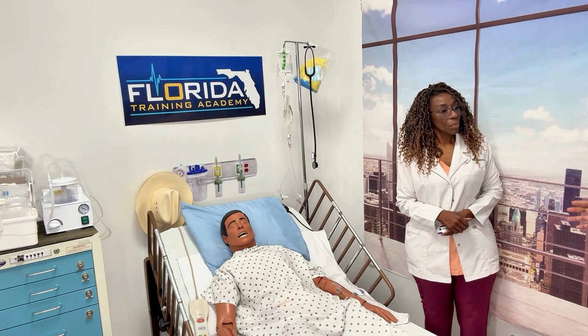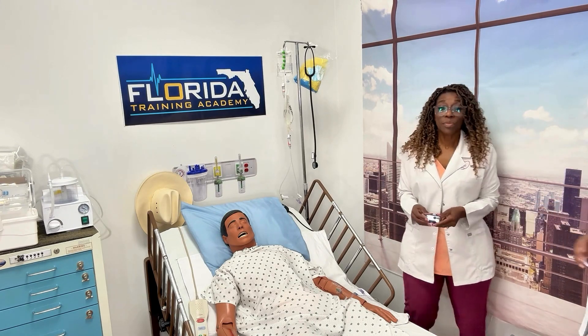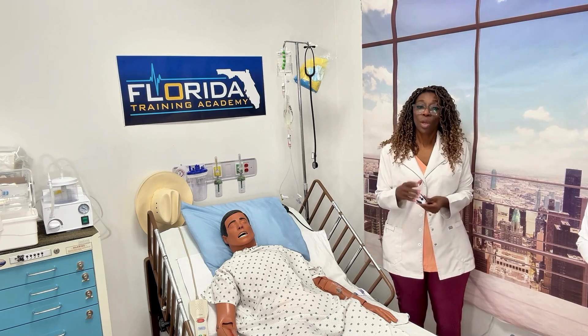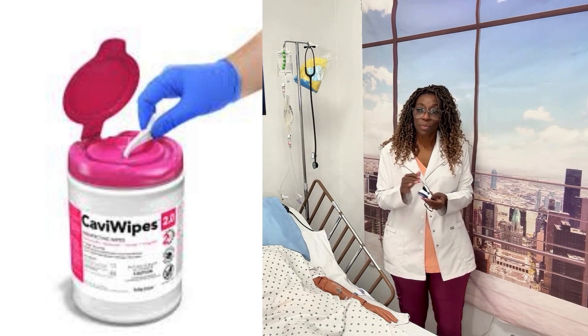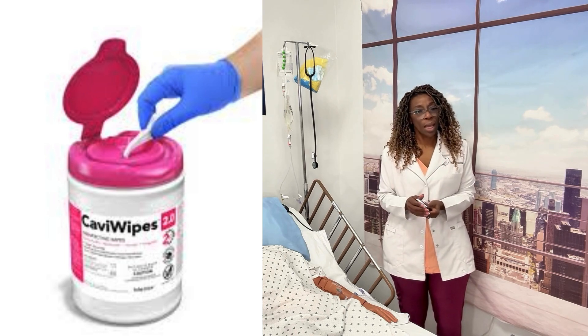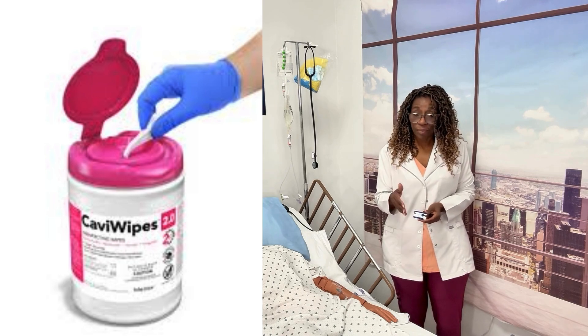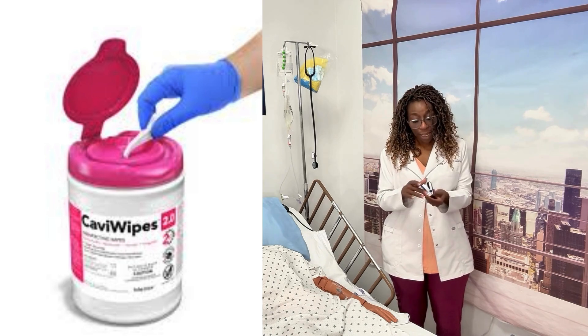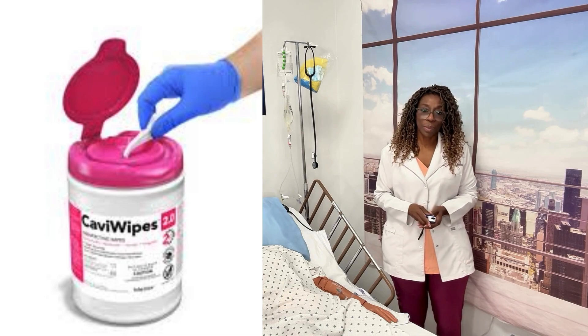What about cleaning the device? Since we sometimes use these on multiple patients, after using it on a patient you take a wipe and clean it off really well. Use an alcohol swab if you have one, or a towelette, and clean it very thoroughly so you can use it for the next patient.